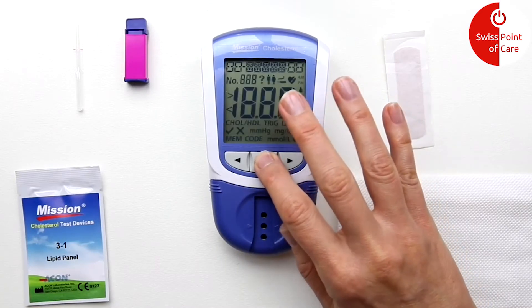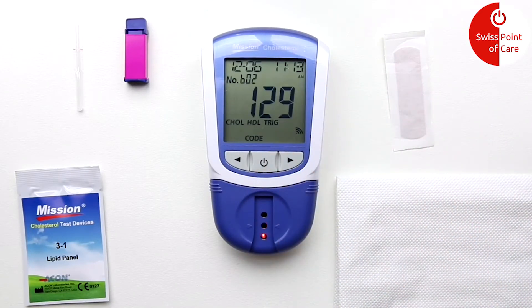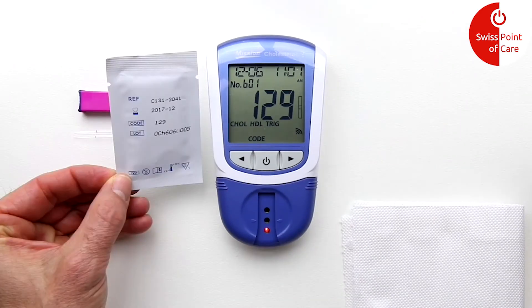Turn the meter on by pressing the on/off button. After the meter starts up, the start window will appear. Ensure that the supplied code chip is installed and that the number on the display matches the number on the test strip bag.